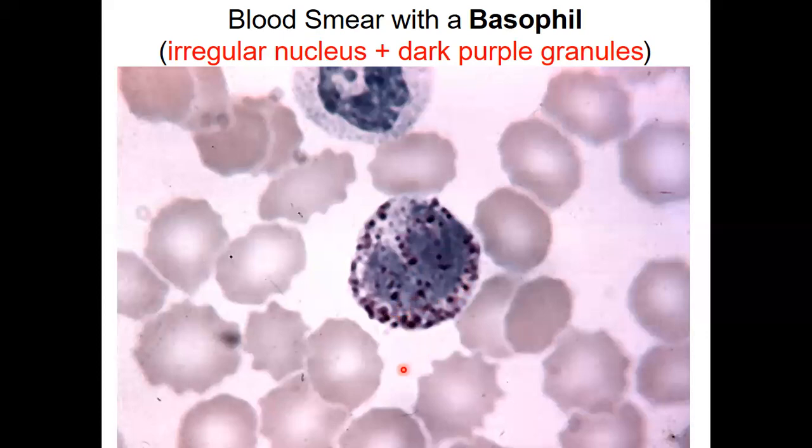So as you are drawing neutrophil, basophil, and eosinophil, make sure that you also draw the surrounding red blood cells for comparison's sake. So all red blood cells near these cells must be drawn.